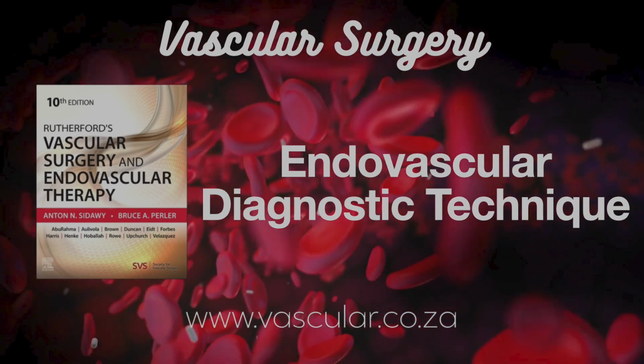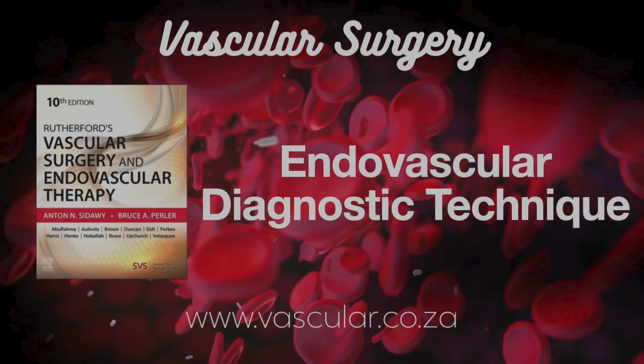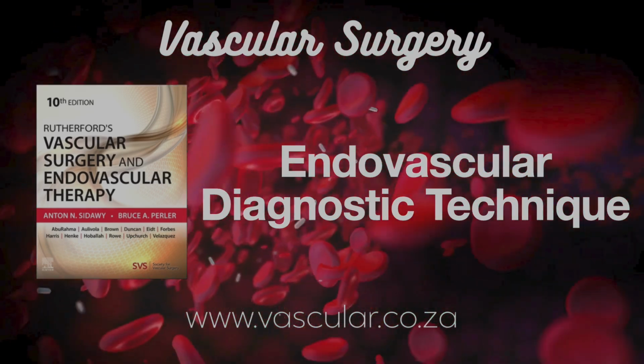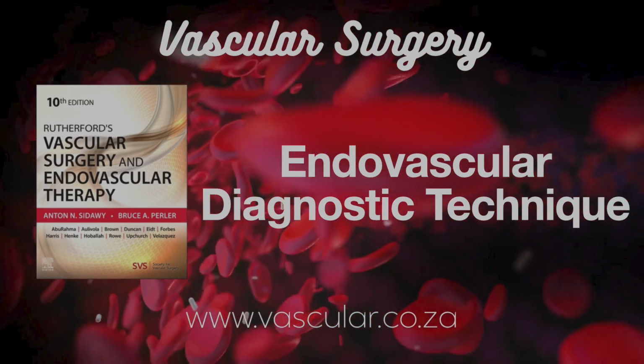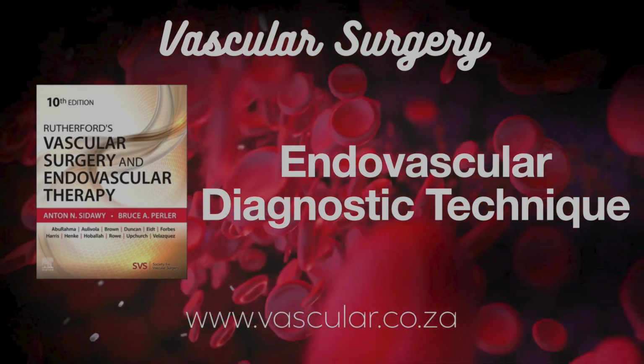What about those arteries even further down, infrageniculate or pedal access? Right, pedal access, gaining a lot of favor actually, especially for tough blockages in the tibial arteries when you can't get through from above. How's that done? Almost always with ultrasound and micropuncture needles. Often you don't even put a sheath in, just work with the wires and catheters directly.